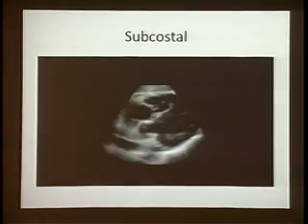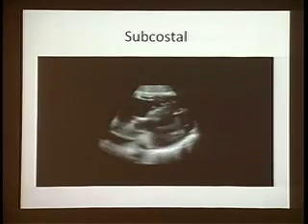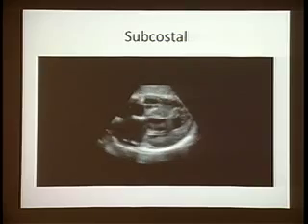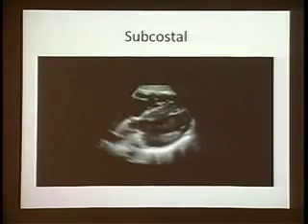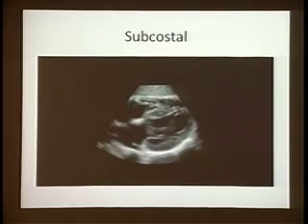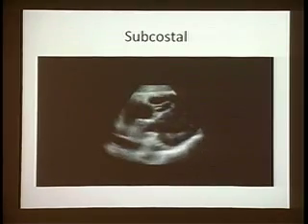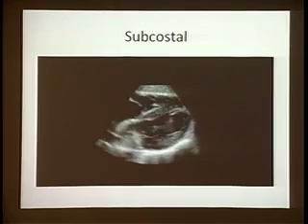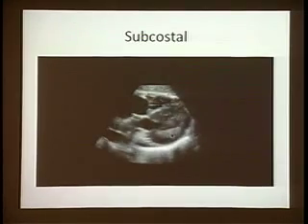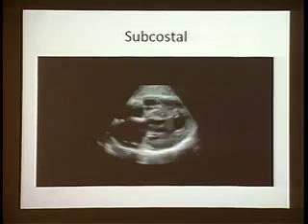We give you a live view here. Because you can see, is there an effusion around the heart? No. That bright line that you see here is pericardium. Is the heart contracting or not? Yes, the heart is contracting. You can even tell this heart might be a little bit thickened. Okay, it's a little bit of hypertrophy just from eyeballing it, not even measuring it. Okay, the right heart doesn't look bad. It doesn't look dilated, and you'll see it when the right heart dilates. It's obvious because it becomes bigger than the left heart. So you should be able to pick up things. So a good subcostal view gives you a lot of information.